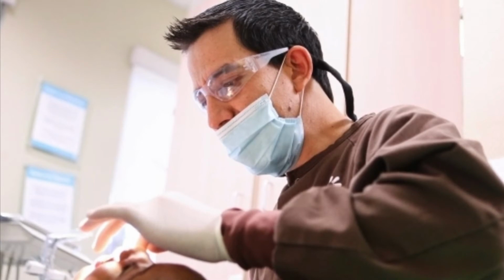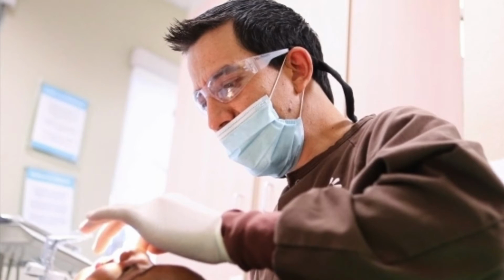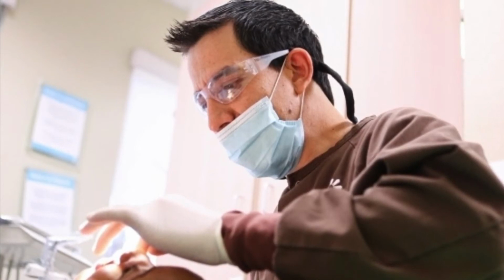This is the reference point. It is at the tip of the cusp or the tip of the incisal edge. Very clearly, you will see it when you work with the tooth.